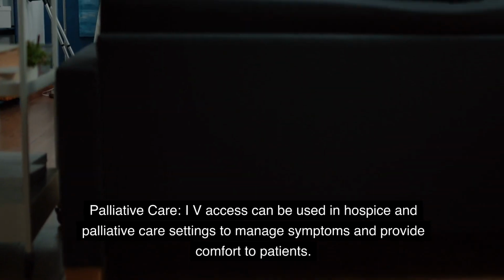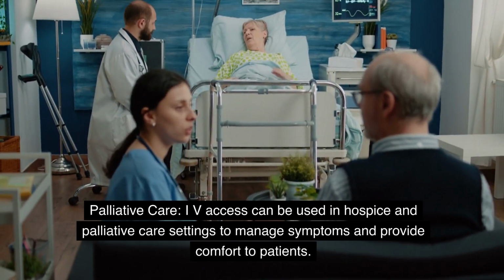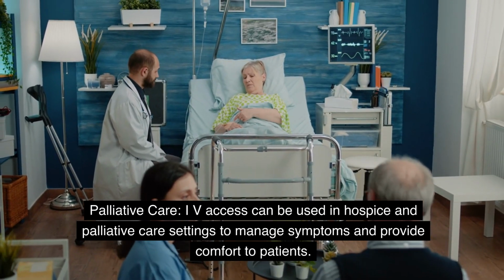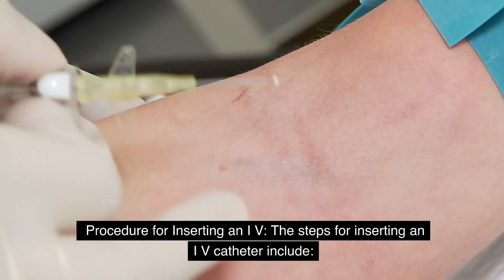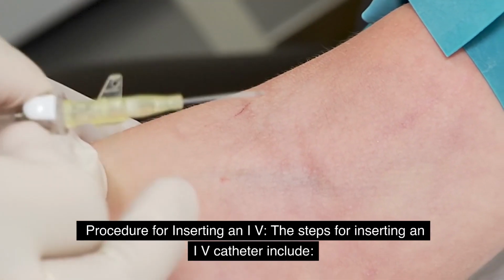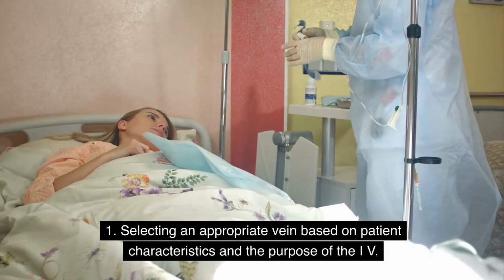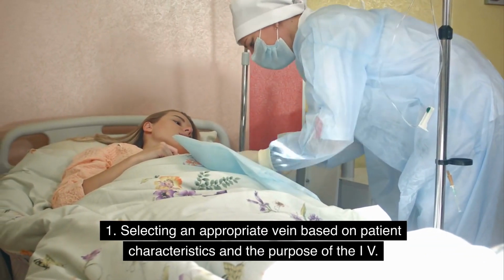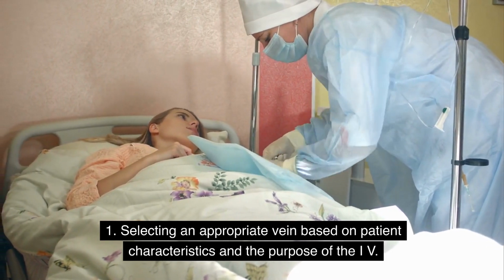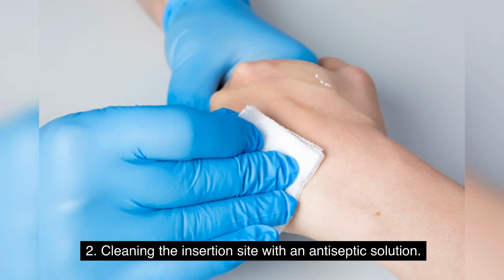Palliative care. IV access can be used in hospice and palliative care settings to manage symptoms and provide comfort to patients. Procedure for inserting an IV. The steps for inserting an IV catheter include: 1. Selecting an appropriate vein based on patient characteristics and the purpose of the IV. 2. Cleaning the insertion site with an antiseptic solution.